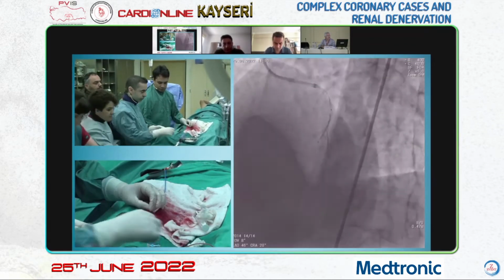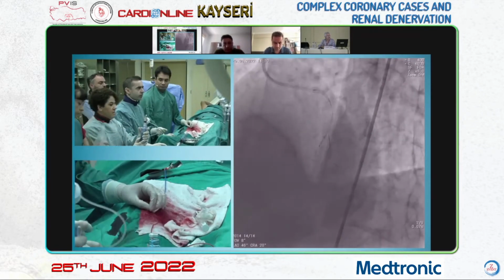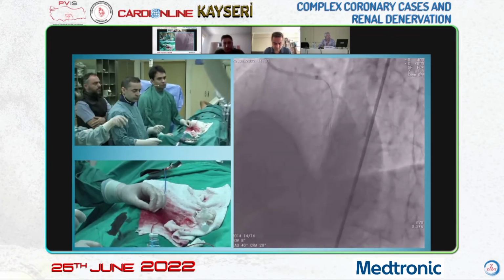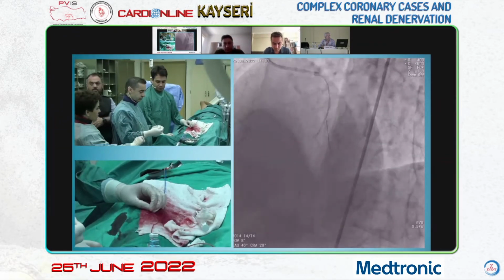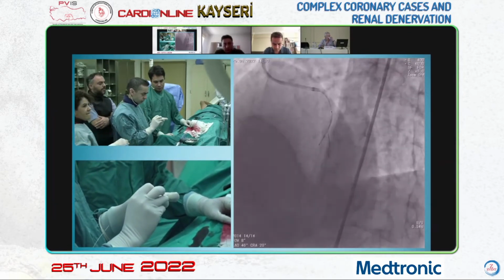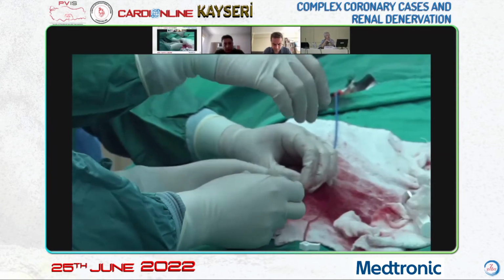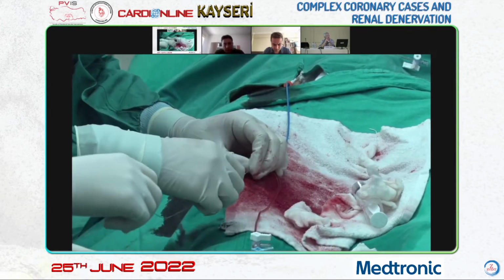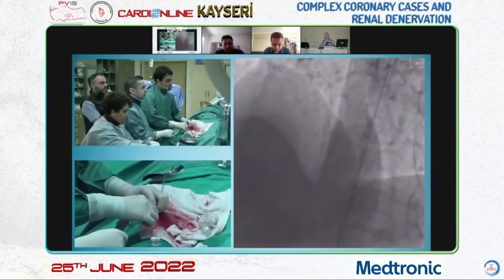There's no atherosclerotic plaque that is seen. The effect of the medicated balloon is that it will block the proliferation. If there is a spasm, as Kürşat pointed out, if it is about vasomotor changes, I don't think the medicated balloon will help.